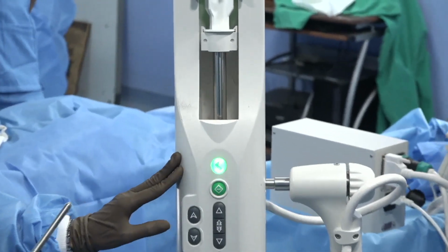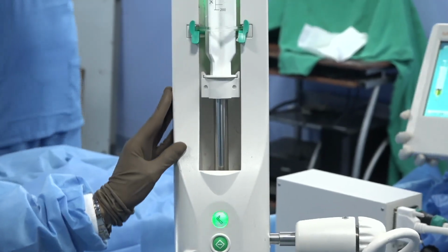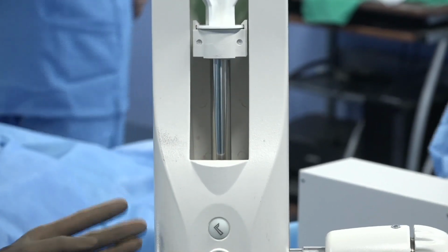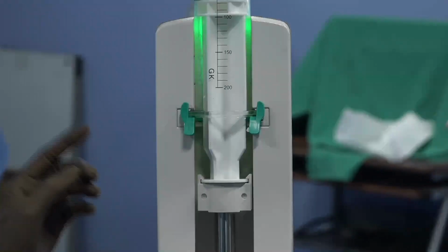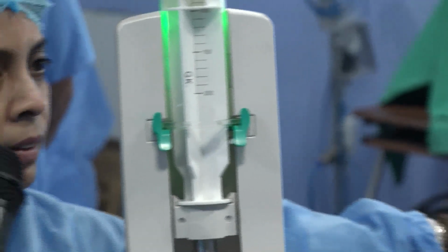We have this in most of our CT scan rooms. It's preferable, if you are doing a PIPAC procedure, that you buy your own. It costs about 4.5 to 5 lakhs. And as, please come. You have to please focus on this. So this is monitored by, can you focus on this?